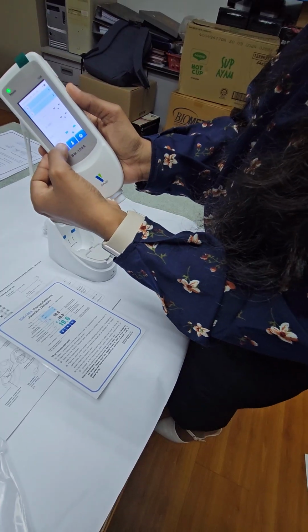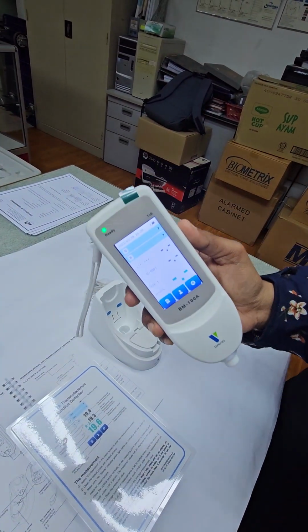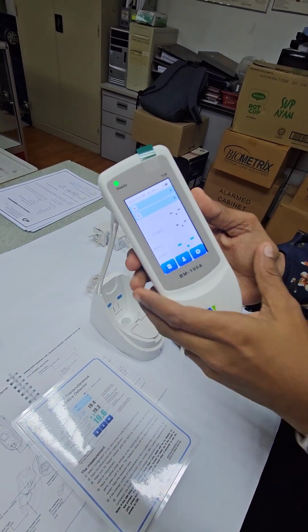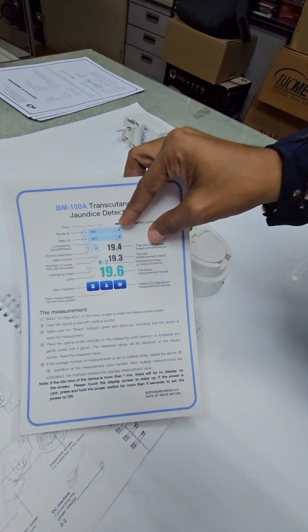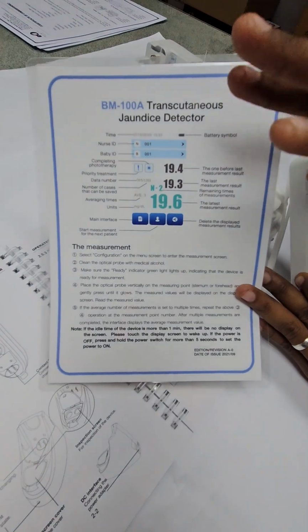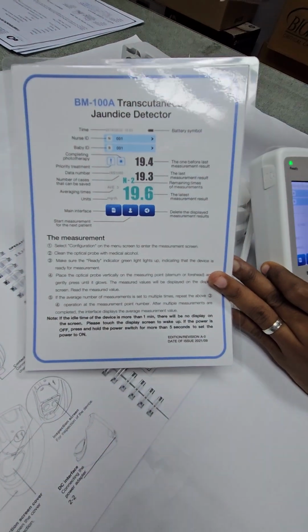Here it will show the measure units and average time. Just now we set it to 1 time. If we set 3, it will show 3. Here will be the result, as you see from the quick guide. The 19.6 here is the new patient. Let's say we have 3 patients now. This is the latest patient, and these 2 are the previous patients.